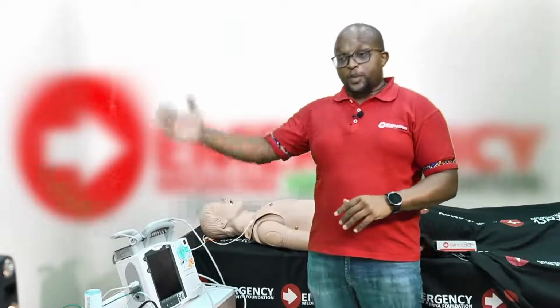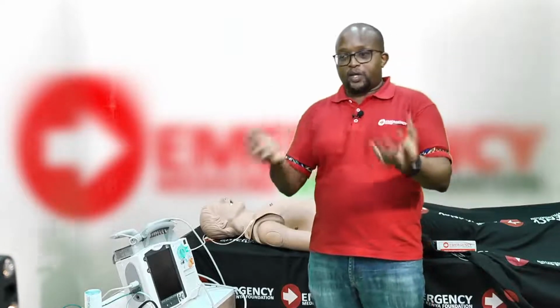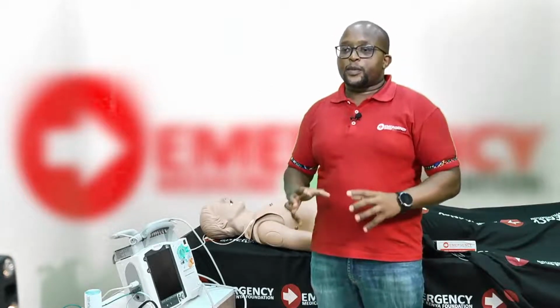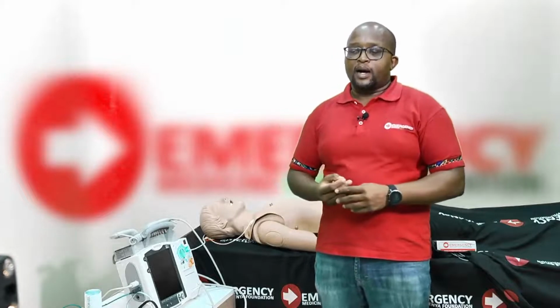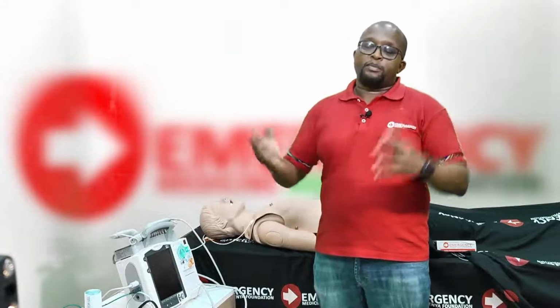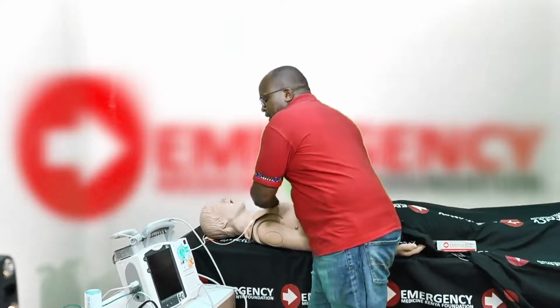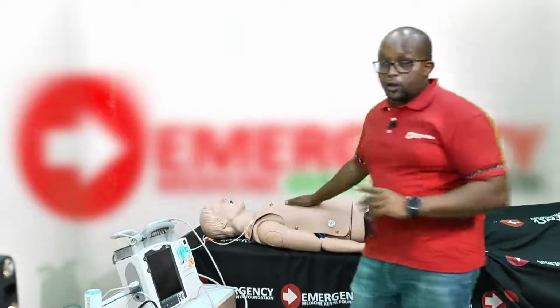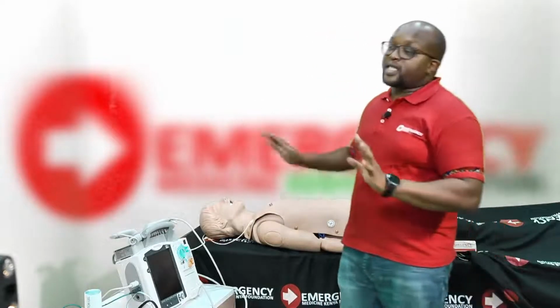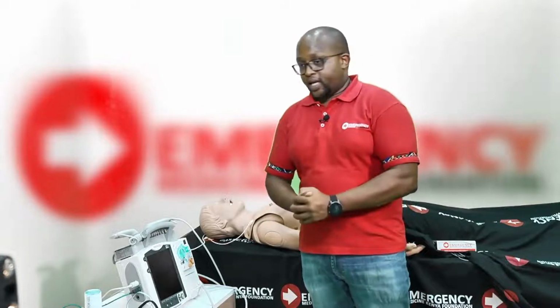You'll check the rhythm after 2 minutes of CPR, because your fibrillating heart doesn't have blood in it. It's just shaking, and it's empty. So your 2 minutes of CPR fills the heart chambers with blood, allowing the heart then to be able to pump blood effectively. That's why the moment you shock the patient, quickly put back and resume CPR. Do not check if it has worked. You will check at 2 minutes when you're doing your rhythm check.